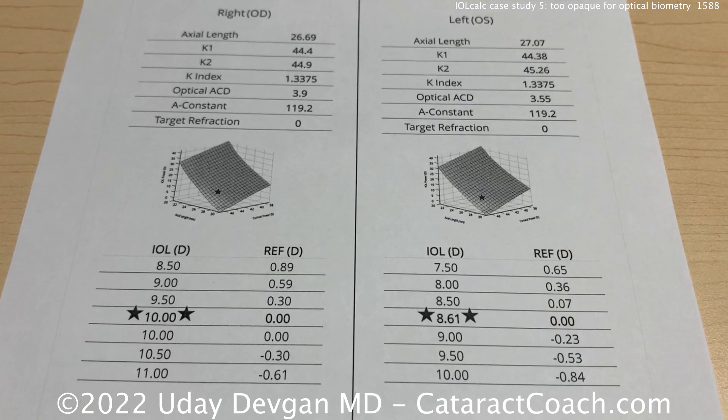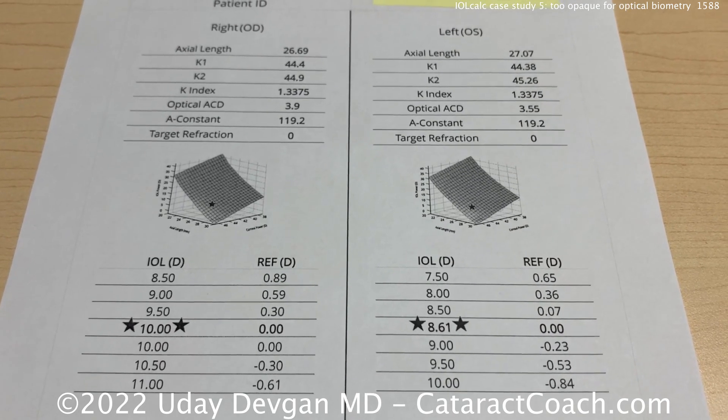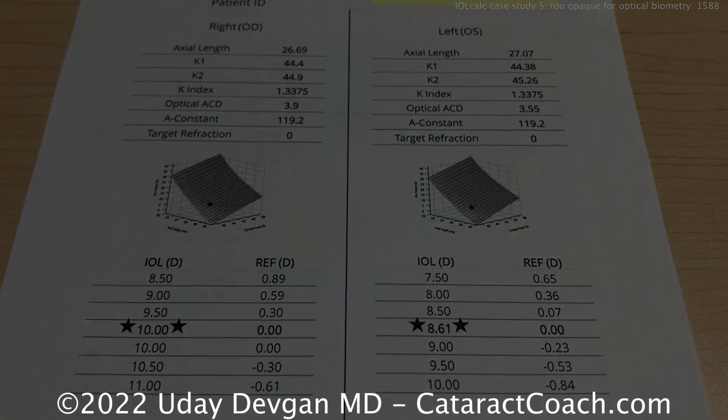For these dense cataracts where you can't get an axial length — here's how I handle it with ultrasound, and these are my little secret pearls.